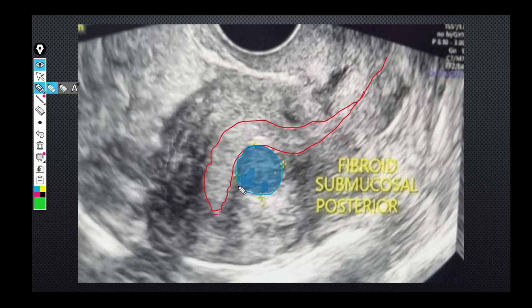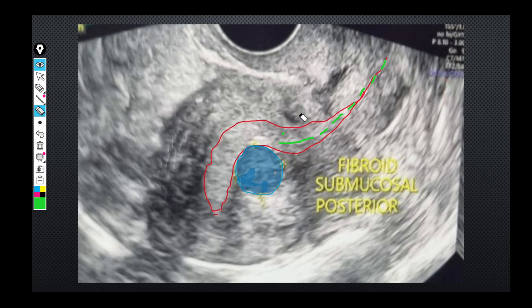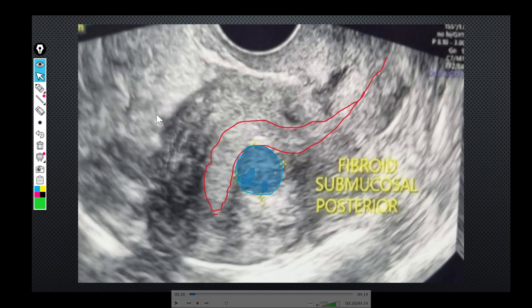If we draw this out, this is the fibroid and this is the entire endometrial cavity. You can see that the fibroid is indenting the endometrial cavity at this level, and this is the entire projection of the fibroid into the endometrial cavity. If you follow the endometrial canal, you can see it goes this way and then turns after a certain point. That is the point at which the fibroid starts its indentation inside the endometrial cavity. Let us see how we are going to use that information while planning our surgery.